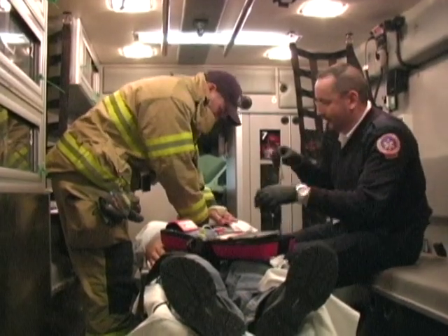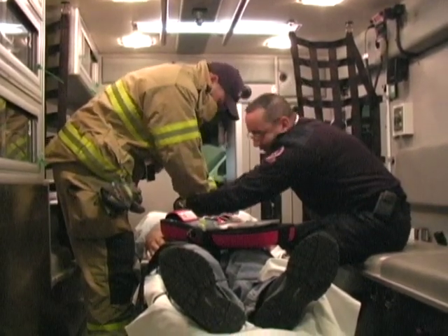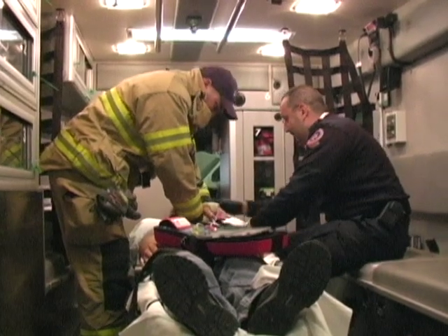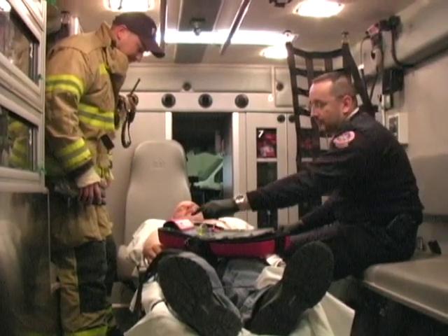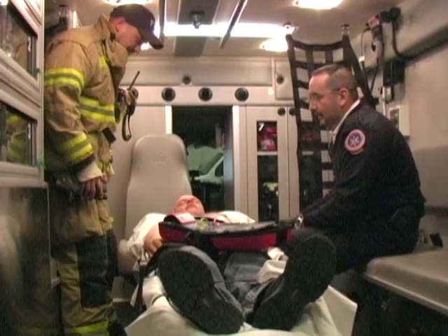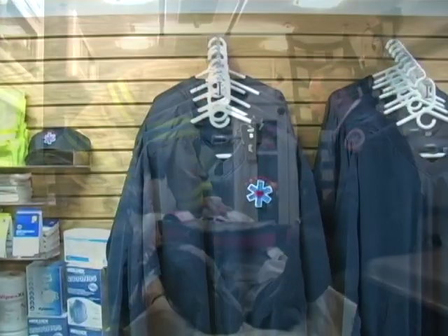When the AED is analyzing, it is very important that you make sure there is no movement of the patient. This includes pulling over to the side of the road if you are in a vehicle while it is analyzing, and making sure there is no unintentional vibration of the patient while analyzing. This unintentional vibration may cause the machine to misread the rhythm and give an unnecessary shock.